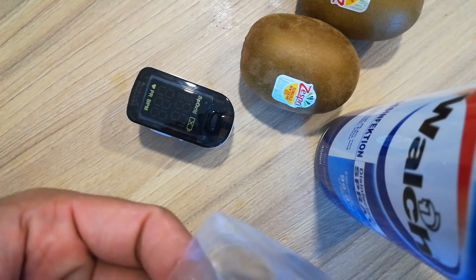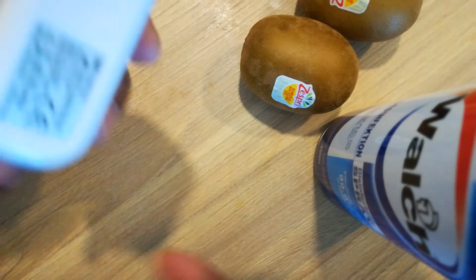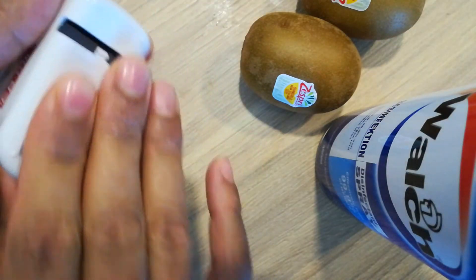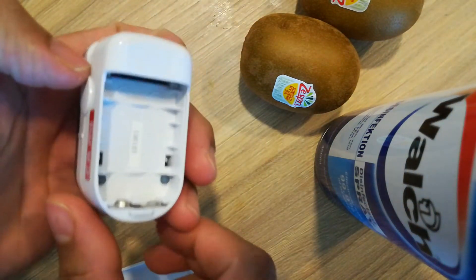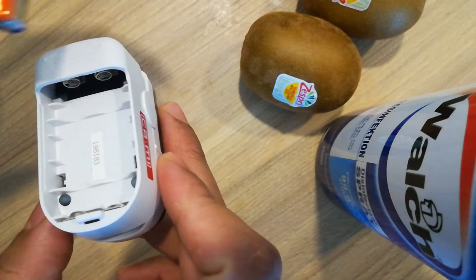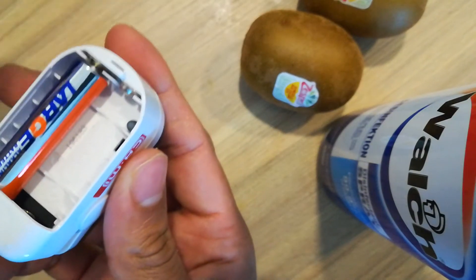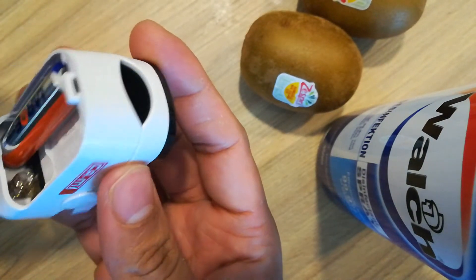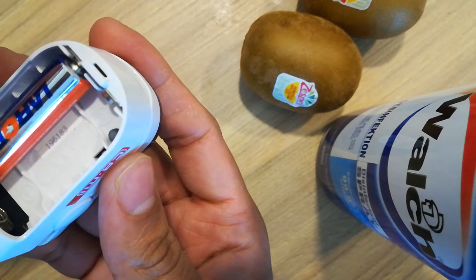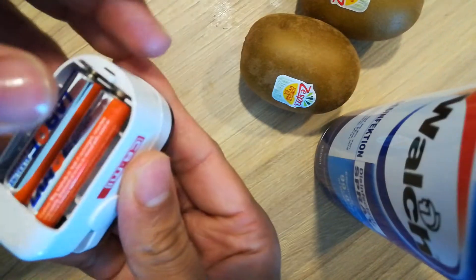Today I am going to show you how to install this and how to use it. This is very important now for the COVID-19 situation. You can put the batteries — plus minus — like this.